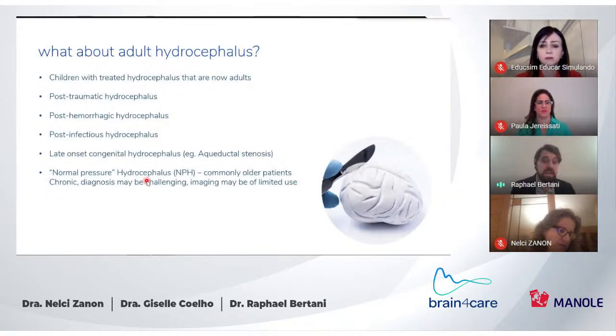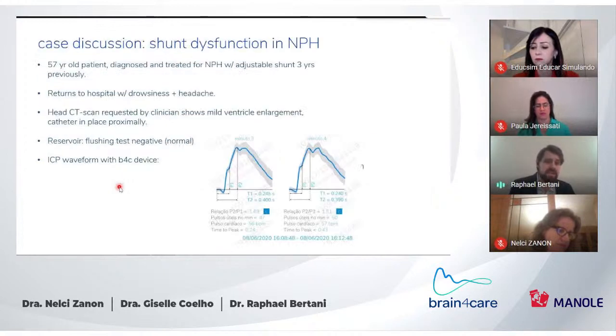And it's also something we need to be aware of and treat, not only for the children that already had it and are now adults, but also for the others that may develop it for some other reason. And I brought to all of you a case in which we used the device. So we had this 57-year-old patient diagnosed and treated for NPH 3 years before, and he had an adjustable shunt. He returned to the hospital. He's drowsy. He has been complaining of headaches. He's very debilitated.